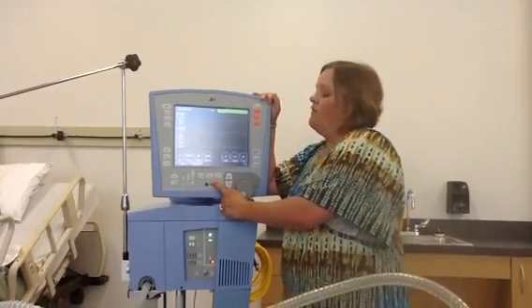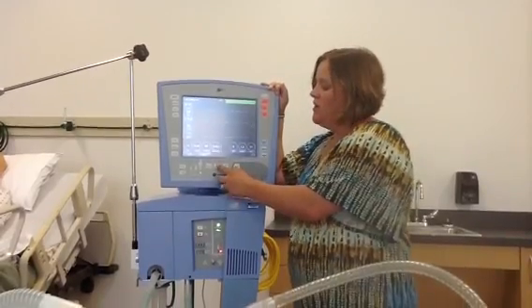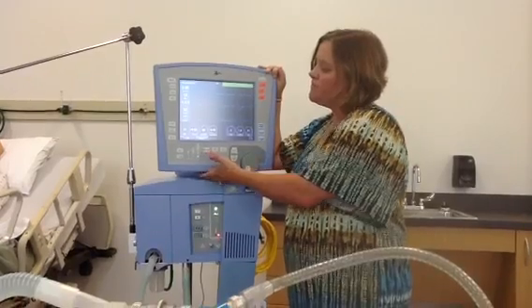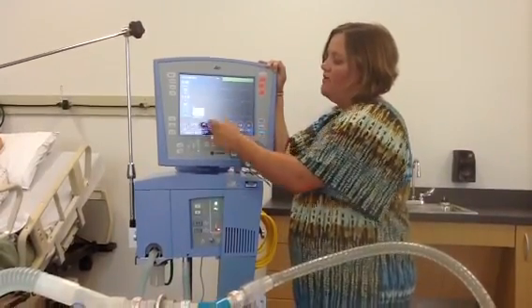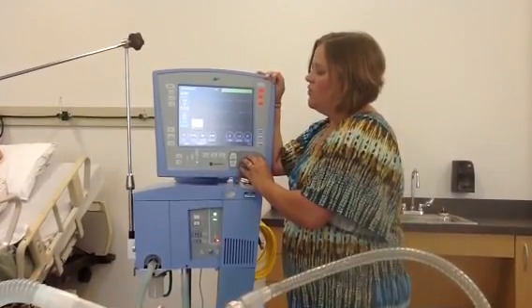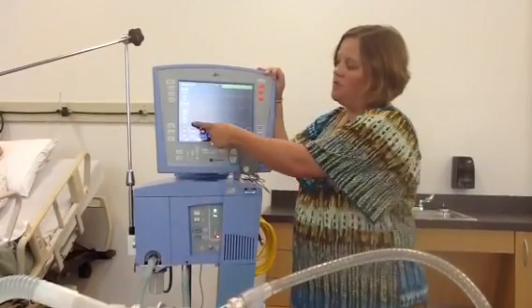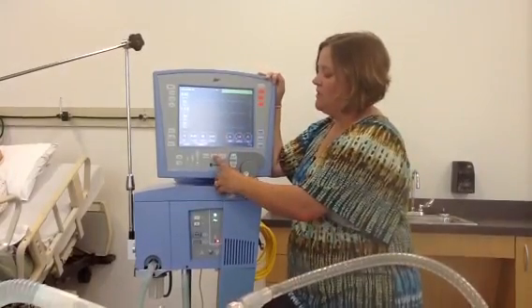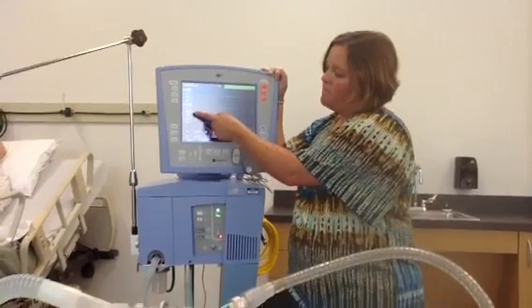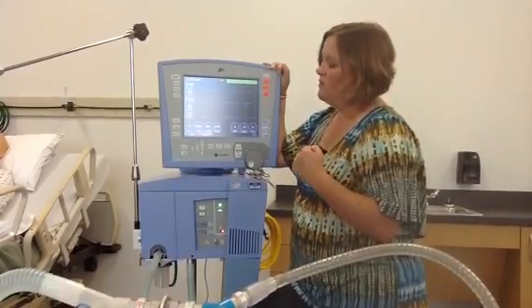Anytime we're trying to ventilate a patient on a volume control mode, we would want an inspiratory hold to get a plateau pressure. The inspiratory hold does have to be timed with the patient's breaths — breathe in, hold, release. You should have your ventilator set up so you can see your plateau pressure. Wait to read your peak pressure on the very next breath. Peak pressure was 33 and plateau was 31 — that's how that works.